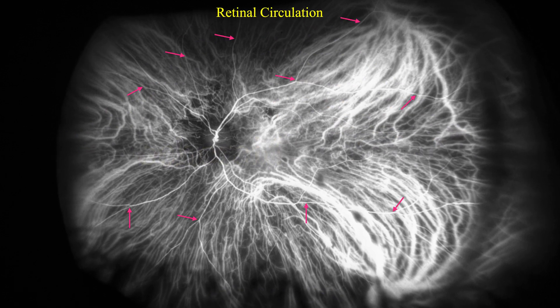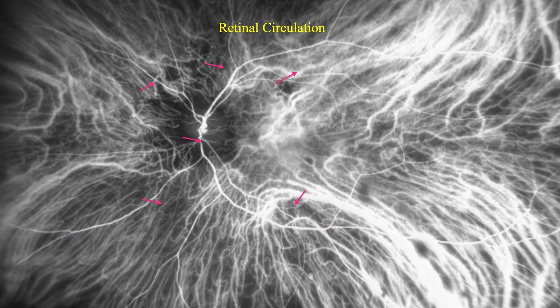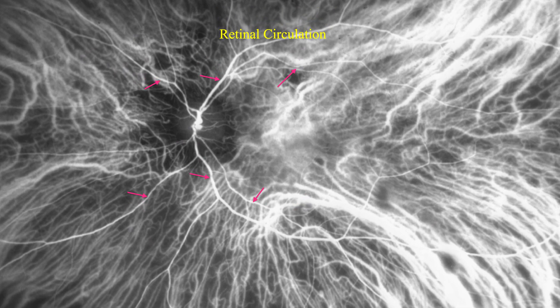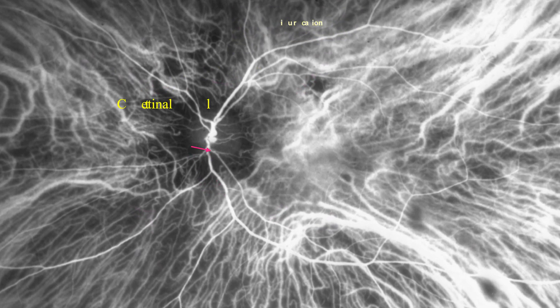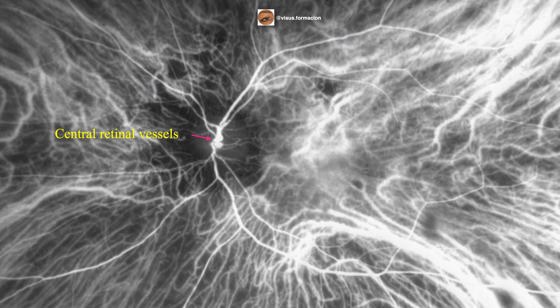In this photograph, we can see the two superimposed circulations, and indicated with the arrows, we specify the retinal circulation. Through the optic disc pass the central retinal vessels — the central retinal vein and artery.